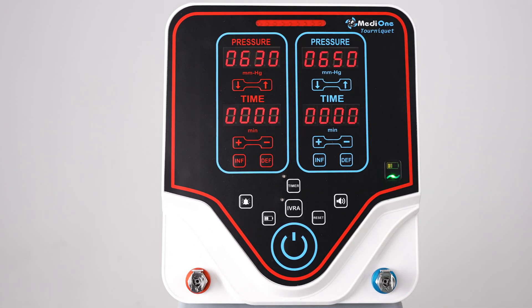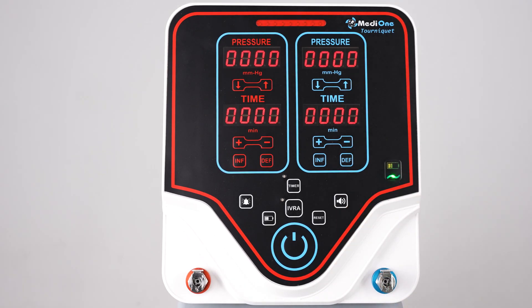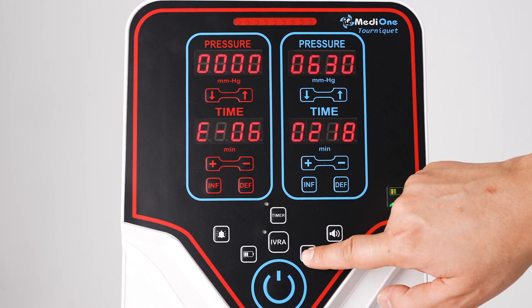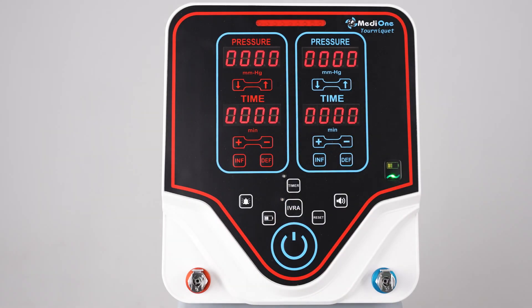After the operation has started, you need to activate the timer button to see the remaining time until the end. Use the button with the speaker icon to adjust the volume of the alerts. When the device gives a warning, use the reset button to silence the alarm. The operating time of the device on battery is approximately 20 hours, and it contains a lithium-ion battery. Press and hold the battery button to see the remaining battery level.